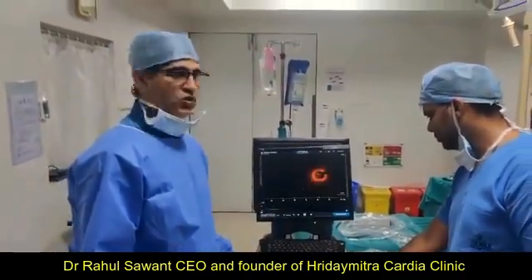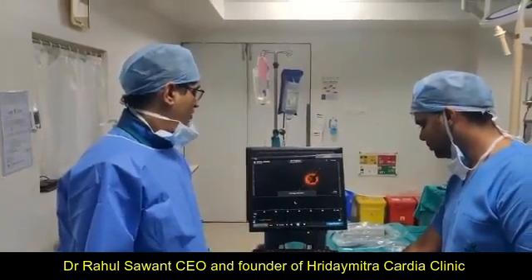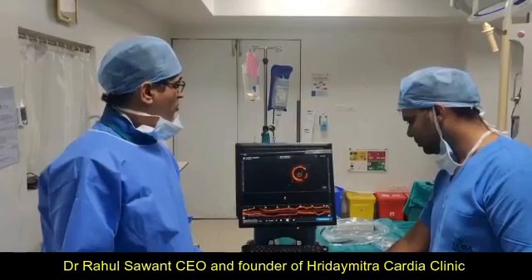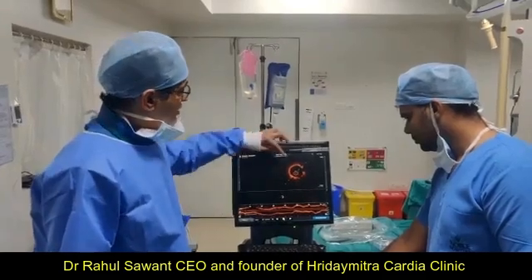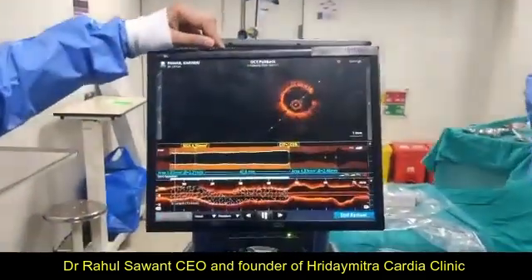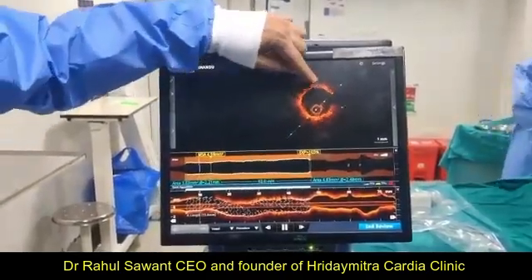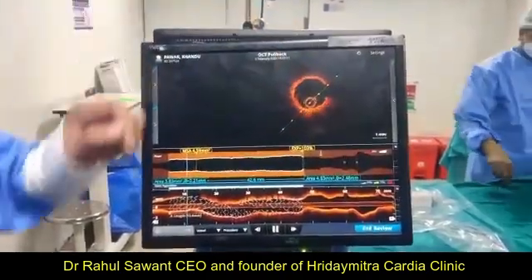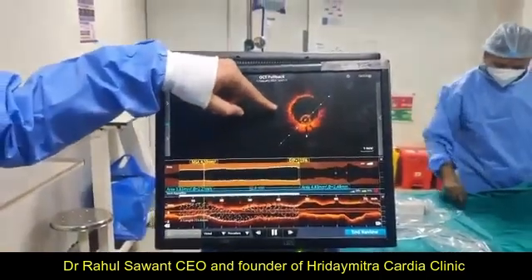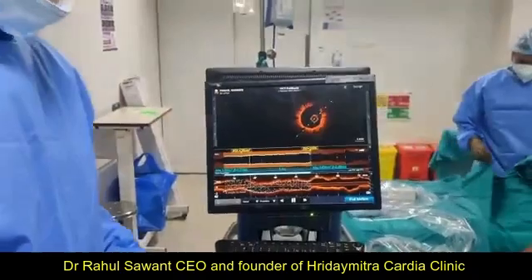Now I will show you a picture after doing the angioplasty. This is a run after putting a stent inside. You can see the blockages here, and what you can see are the stent struts which look like sun rays — these are shadows caused by the metal, giving a sun ray appearance.